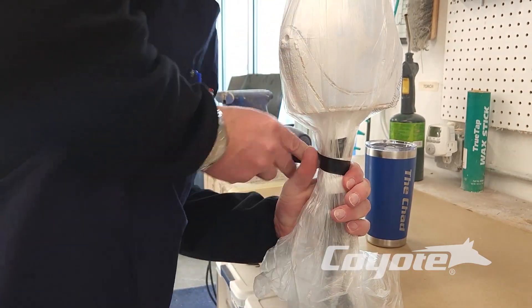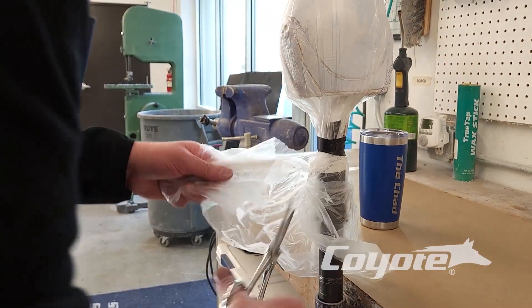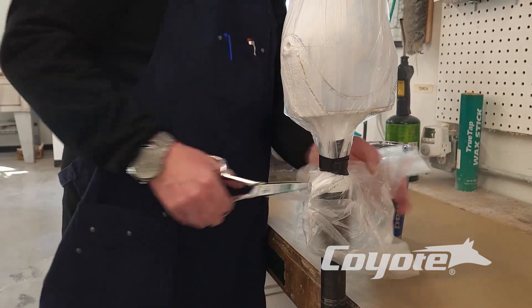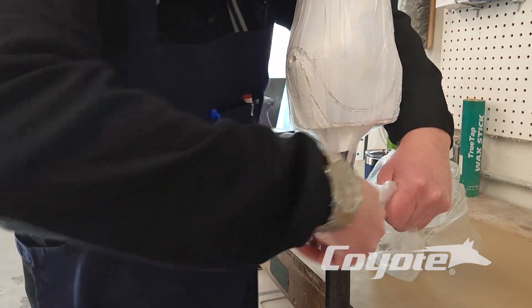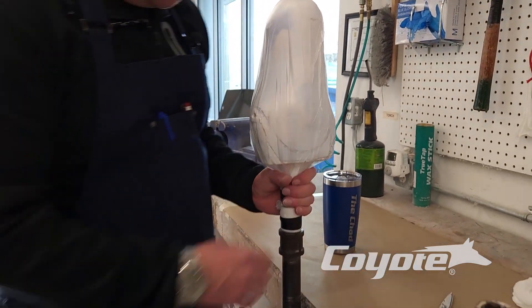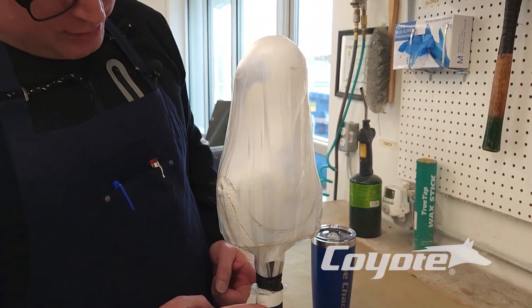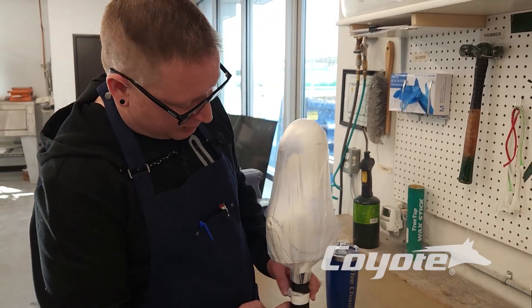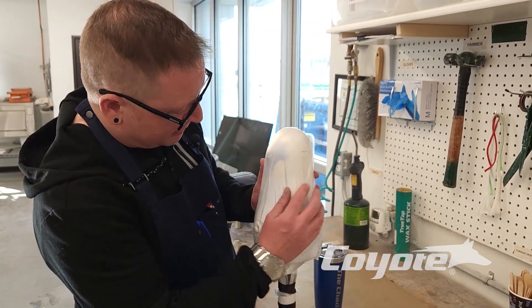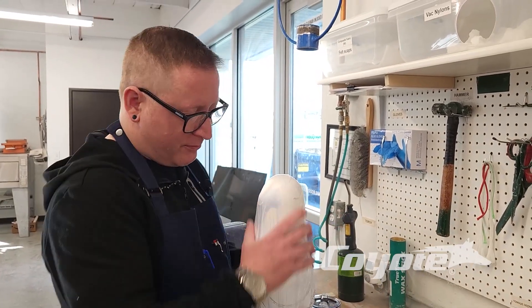We'll do our quick little tie-off here. So the first one is getting the vacuum through the upper holes. Now the lower holes are still getting vacuum and they are open, but that still allows enough vacuum to draw down to suck down our first PVA bag.